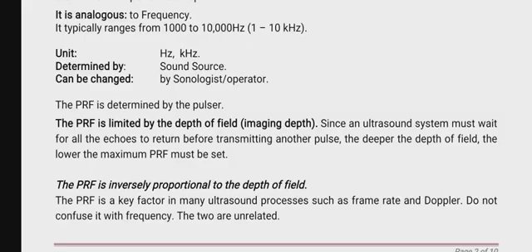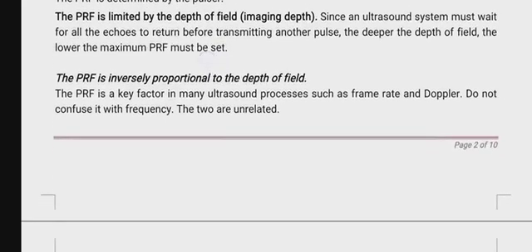But we'll see how it applies as we go. The PRF is inversely proportional to the depth of the field. The PRF is a key factor in many ultrasound processes, such as frame rate and Doppler. Do not confuse it with frequency. The two are unrelated.